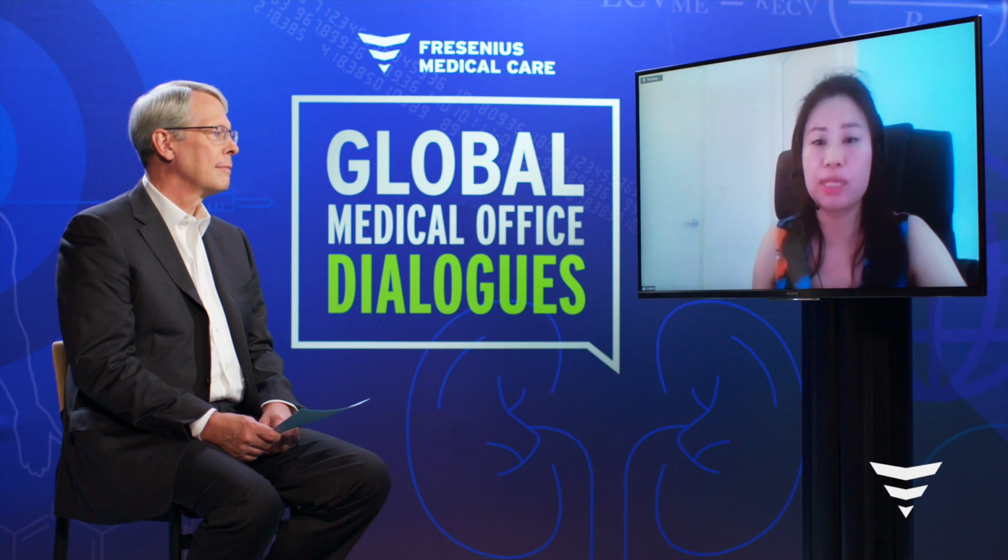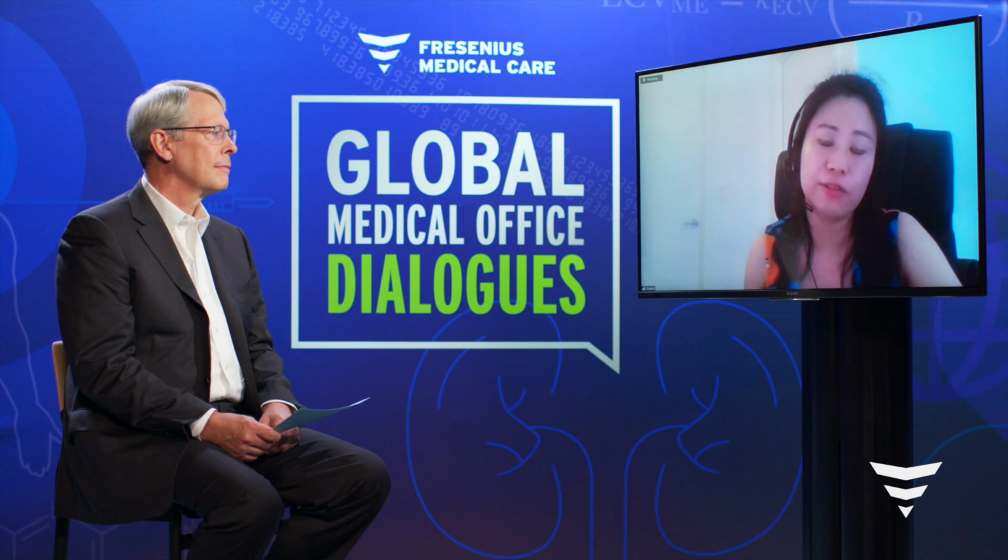Currently we have collected about 700 images so far. I already sent these images to our vascular access experts, and they are doing the adjudication right now. I'm waiting for that, and then I can do the training. But we did some pilot testing before, using a much smaller patient population. At that time we collected videos, so we extracted frames from these videos. It helped us build a reasonably sized image data set.